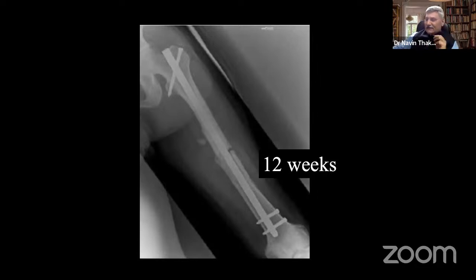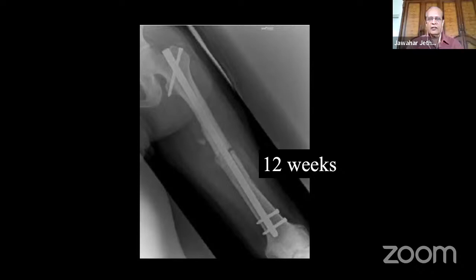Sir, can I ask the question to Dr. Jawahar Jethwa? Because I can see him only. It seems that on the medial side, there is good contact. On the lateral side, it is less. So 12 weeks is a little bit borderline. We may wait for another 1 month. I mean, this is around 3 months.